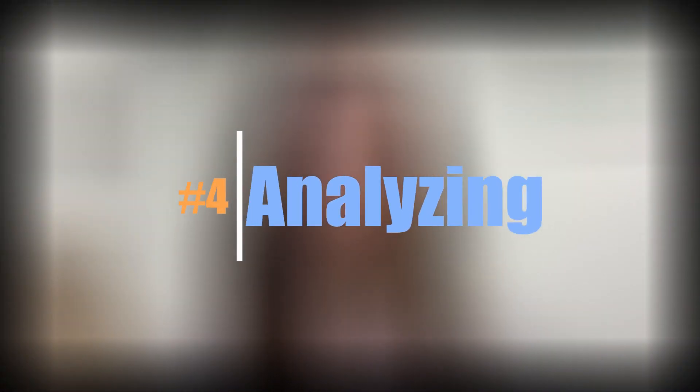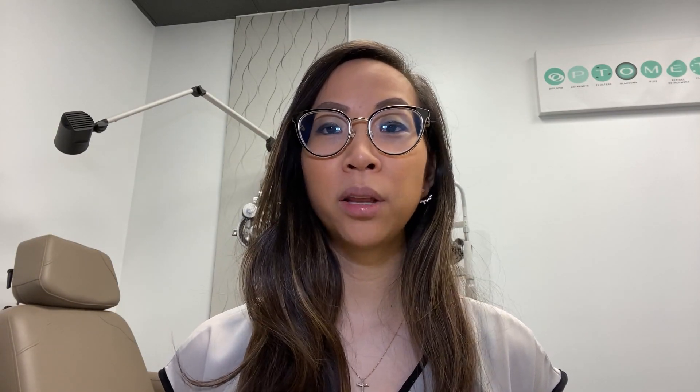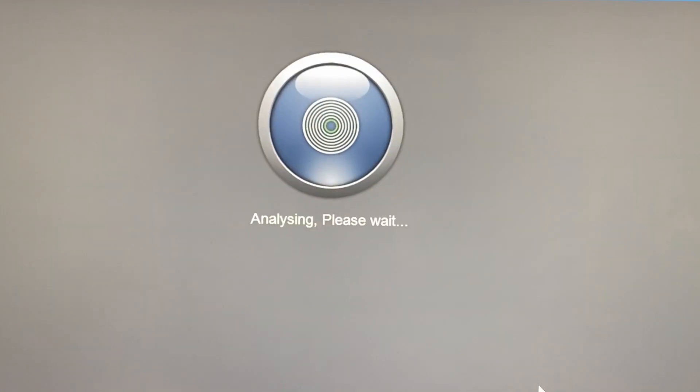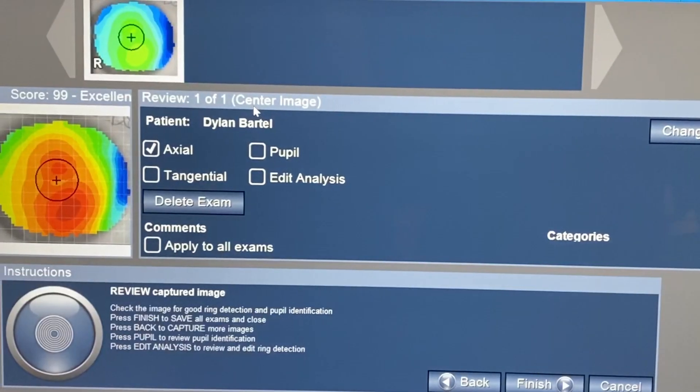After collecting the data points, the software of the Medmont E300 analyzes and calculates certain characteristics of the cornea, such as the power and the shape. While the generated maps are definitely pretty to look at, there are dozens of different display options that give us different information.